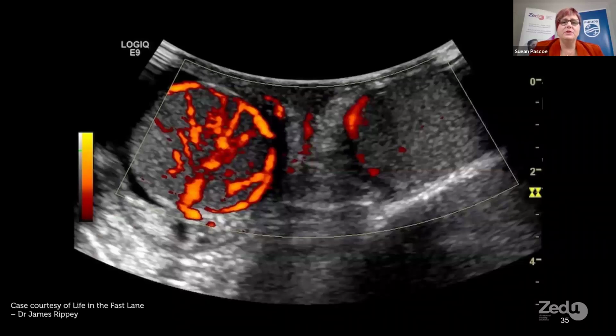So here's a case of a 24-year-old male who presents with 36 hours of right testicular pain. He's not a very good history person and can't remember much detail about the exact onset of the pain, but he has risk factors for a sexually transmitted infection as well. His right testicle is swollen and tender, and so the clinical question is, is it torsion or epididymo-orchitis? Now on this picture, the right testicle shows hypervascularity in comparison to the left. So it typically would fit an orchitis picture.